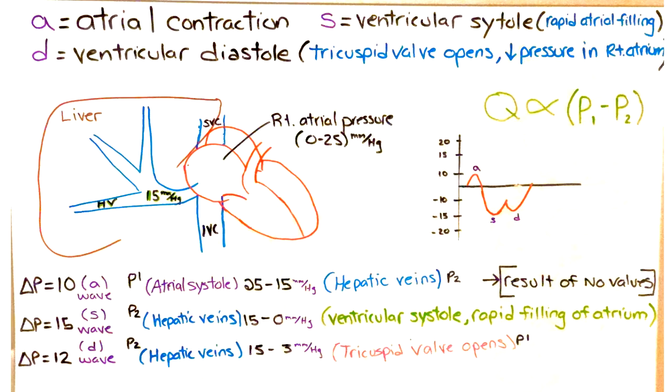Okay, so let me kind of explain that. What causes all of that? Well, let's look here at the PowerPoint. Let's start with the A wave. So what causes this A wave reversal?